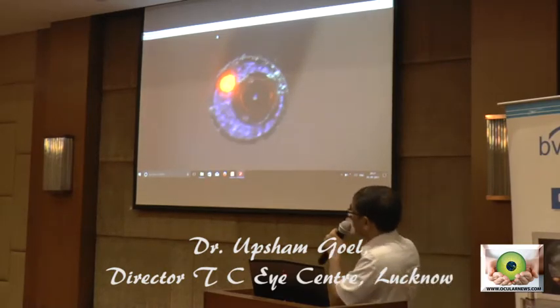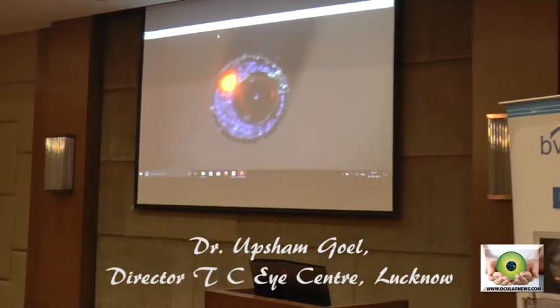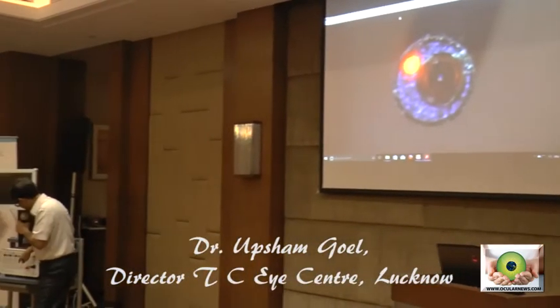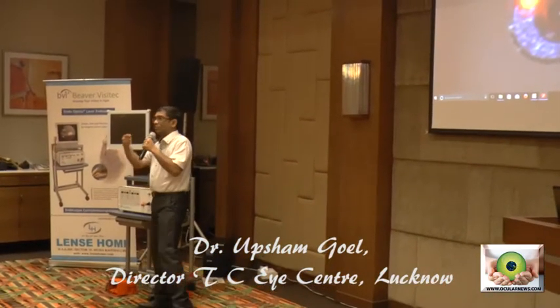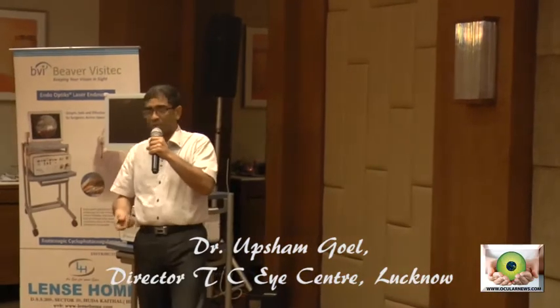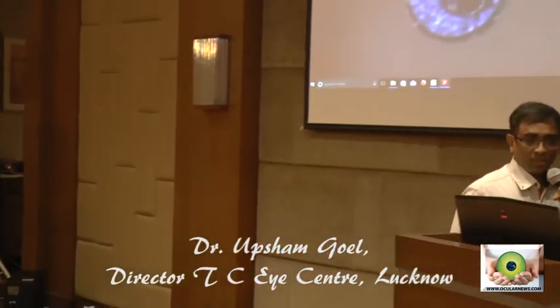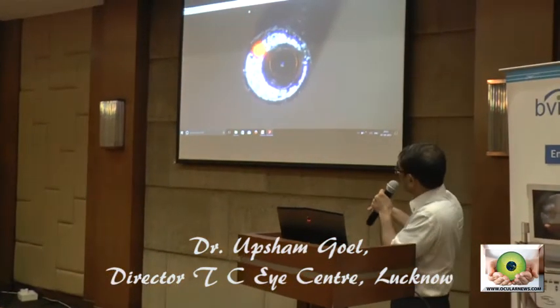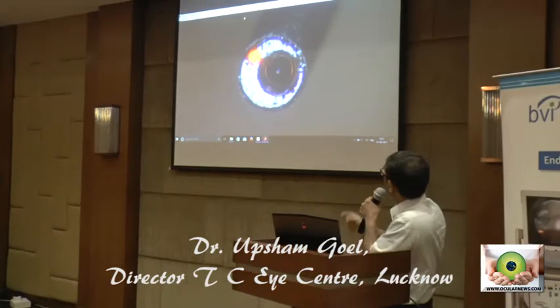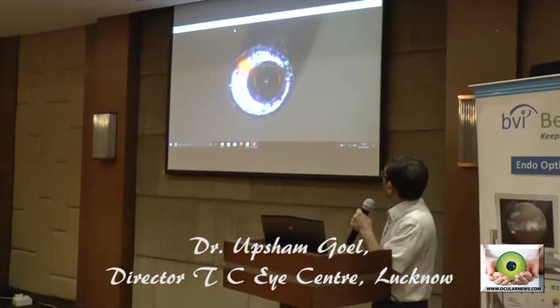The good thing is that you can control it. So here you have the three ports. This is the laser port, this is the camera, and this is your illumination port. So the advantage is that, for doing good photography or even for visualization, you can change the illumination levels for each one of them. So that's the advantage there. Now that's brighter. The previous one was less bright, so I just showed you how you can keep changing the brightness.